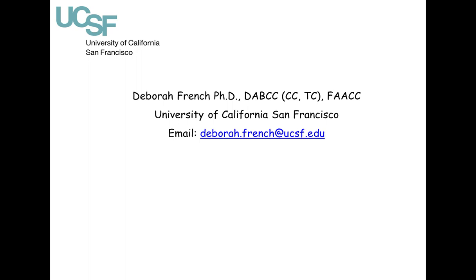Thank you. Your next one is, can you do between-run precision experiments over 5 days, 4 replicates per day? Yeah, so this is a common question. You can. I think the requirement is 20 points. I just wouldn't recommend it, and the reason for that is, like I was drilling home at the end, you really want to throw as many different things at your method as you possibly can. And if you only validate imprecision over 5 days and you do 4 replicates, you're not really getting the variation of different days, different weeks, different people, right? I mean, I guess you could get different people over 5 days.